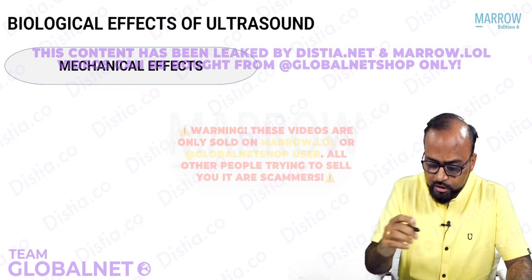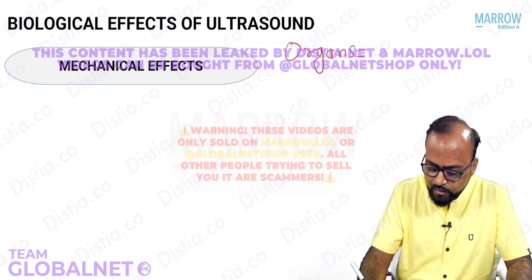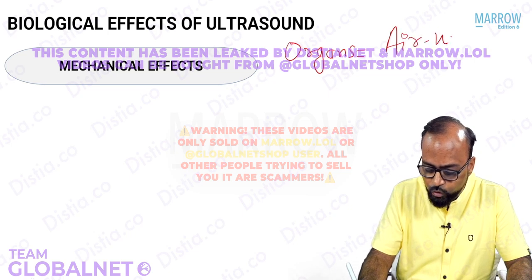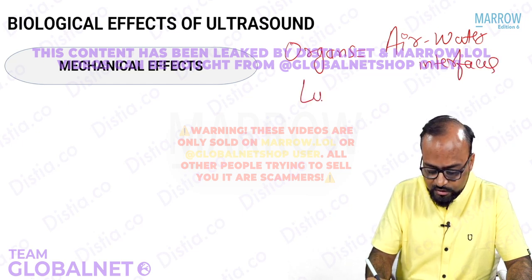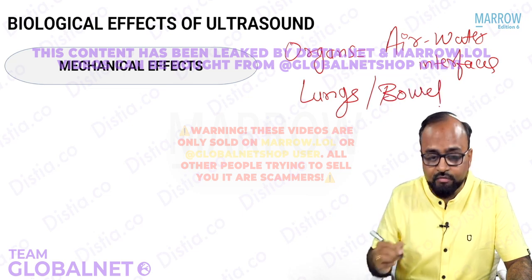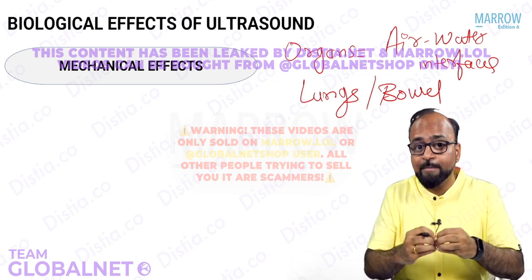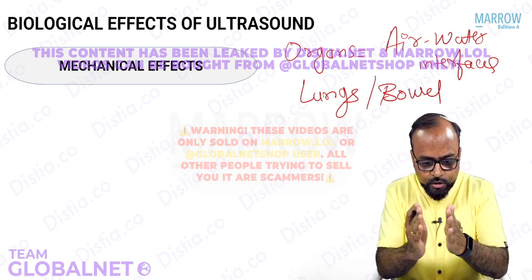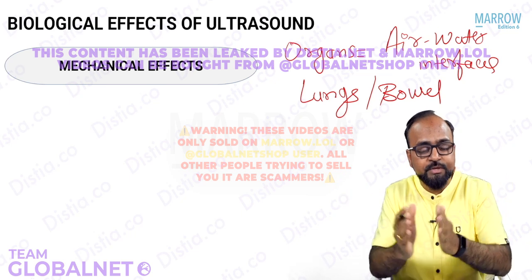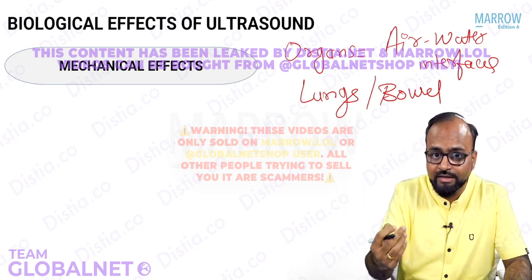This is more in organs that have multiple air-water interfaces, such as lungs, such as the bowel, right? So it is basically giving rise to damage of the tissue. When the tissue gets compressed during compression, suddenly the pressure is released in rarefaction, the tissue can get damaged. This can give rise to mechanical damage.